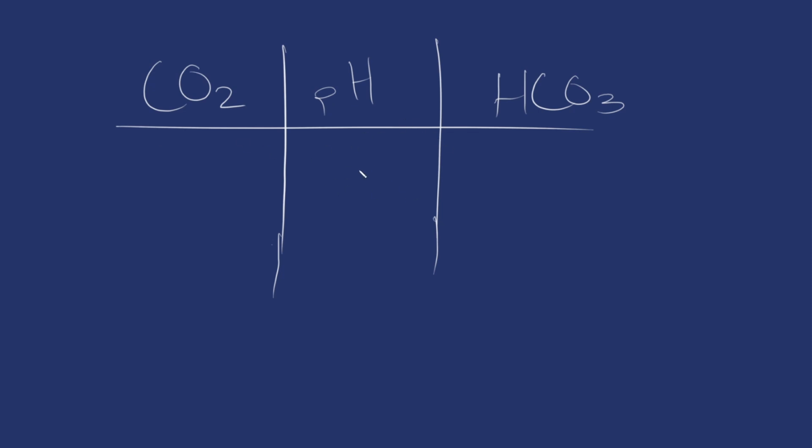All right, so if we look at the pH and it's normal, okay, we look at bicarb and it's normal, and CO2 is normal. So we just do a little hash mark like that. So we don't have any issues. Okay. But now let's say we had a pH of 7.0. Right, so we're outside that 7.35 to 7.45, and we're less than 7.35. Okay, so it's down. Okay, then let's say we look at the CO2. Okay, and it is, let's say, 60. So it's high. Okay, except in this case, because of it being high, it's actually low.